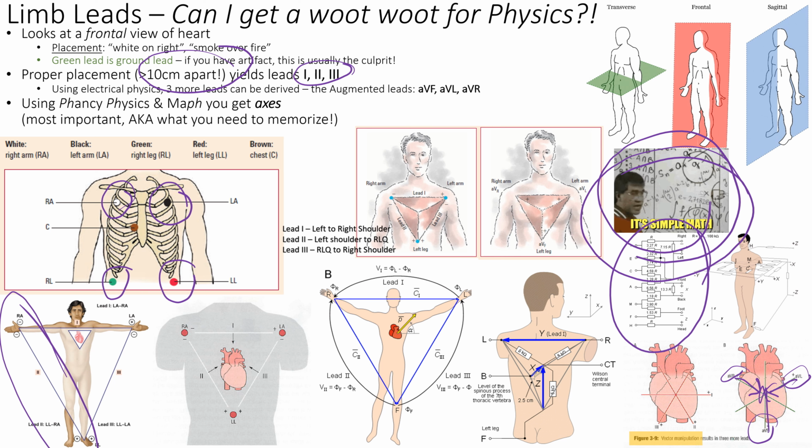It's like a stepchild, we don't care about him until he is important. And it's like, oh shoot, why didn't you tell me? All right, so then we'll talk about that more with pericarditis and left main occlusions. But either way, AVL and AVF are begotten from that.